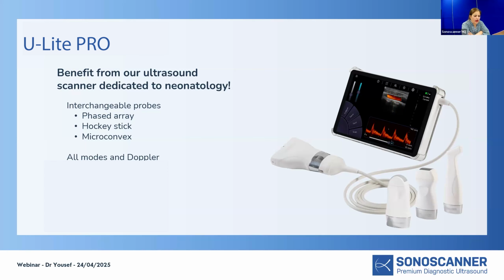However, if you already have scanned your baby and you see the difference, so you have an increase in the number of B lines and you're going towards a severe interstitial pattern, yes, please take that into consideration. And where it is very interesting also is if you are following up babies with congenital heart disease with a shunt physiology. This is definitely a very valuable tool, because you don't want to wait until you have signs of functional heart failure, right? You'll be able to see the lung becoming more and more like a white lung pattern. And this is something that will be very interesting to combine with the echoes.